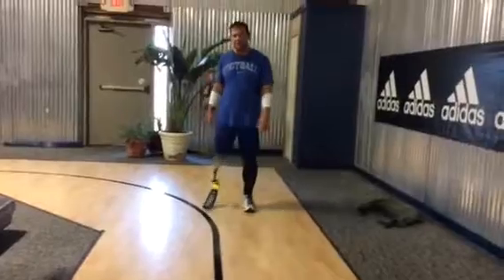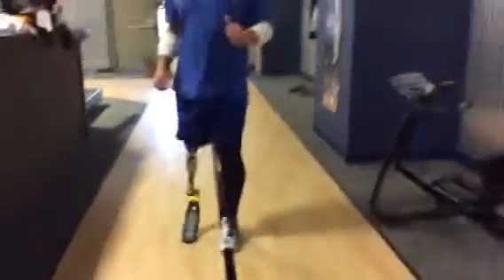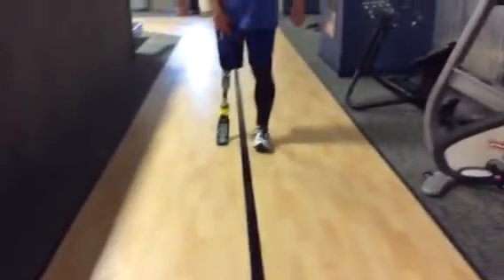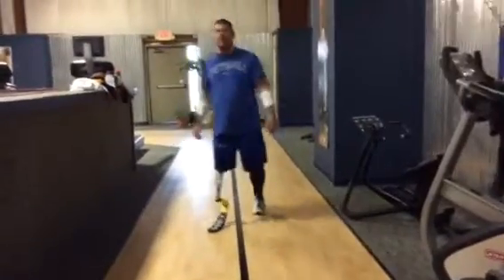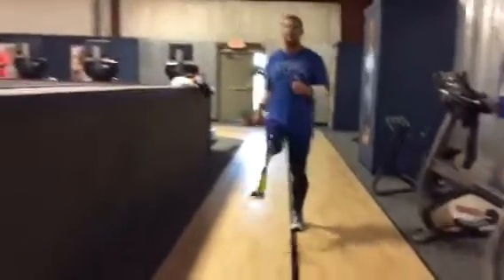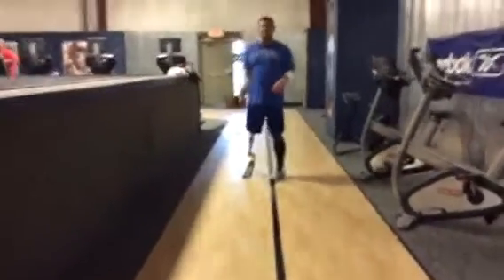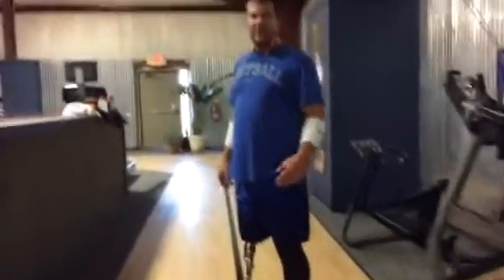But start out slow. You have to drive that leg. You have to drive it back and load the weight on that toe before bringing it forward. Step on the treadmill, see what it looks like as we build up speed. This is going to take a lot longer to build up speed and strength and stamina.